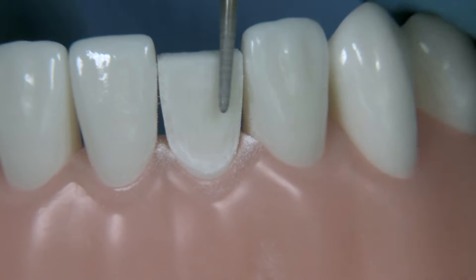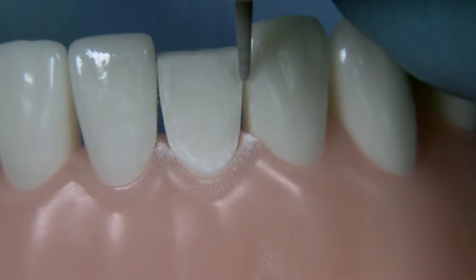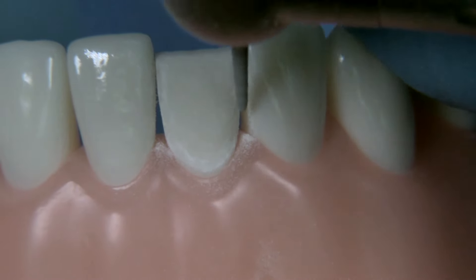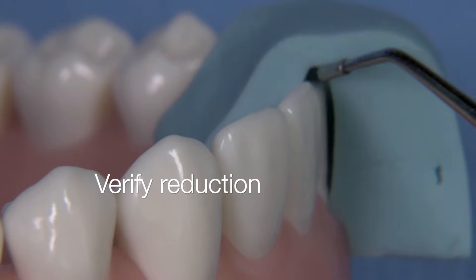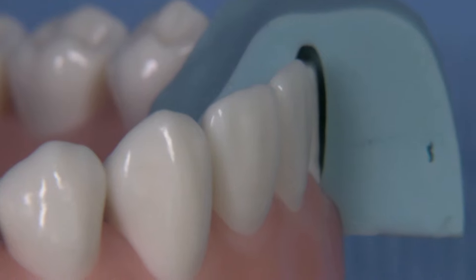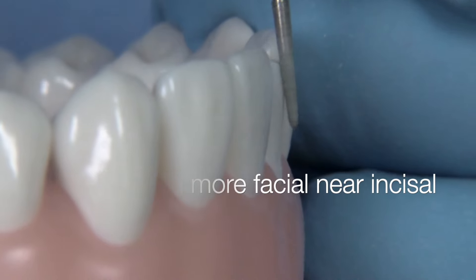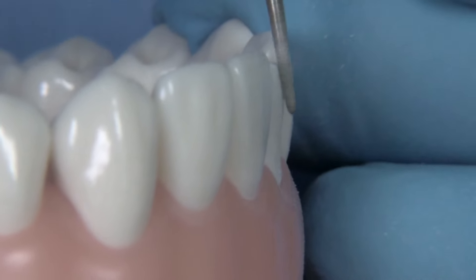My go-to material is still feldspathic porcelain for veneers. I only resort to lithium disilicate when we have a substantial amount of tooth structure missing and I need to support a bilayered approach. You can see that we're reducing the tooth a little bit more, but we still have more reduction to do in that facial-incisal area, so you can utilize the 878K012 following the contours of the adjacent tooth.